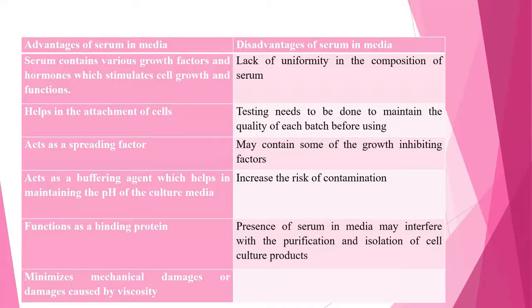Okay. That's because I told you that the serum that is obtained, basically here we use a fetal bovine serum. So there might be interference of factors from the serum with the cells that you're growing. Though it's enhancing the growth, there might be an immunosuppression kind of thing, or it will not bring about the normal growth of the cells. The characteristics of the cells can be changed. The normal characteristics of the cells will be known, but when you observe them after the growth, you might see a change in their characters, as in the size, the shape, there is some deformation or damage done to the cells. So such things can be due to the interference of components in the serum.